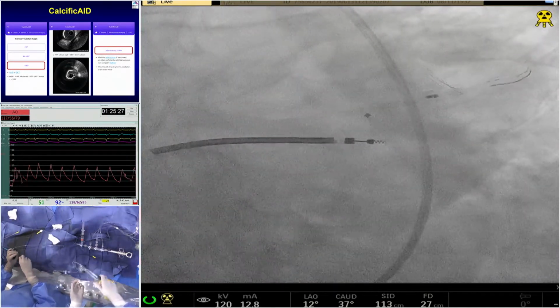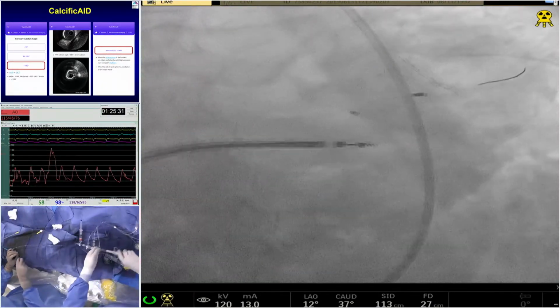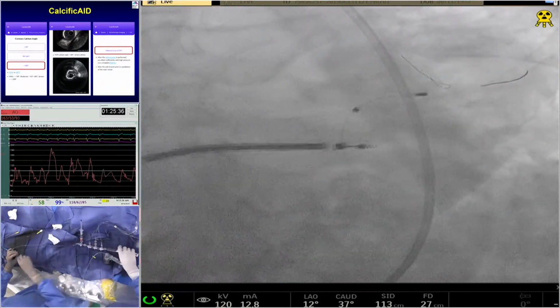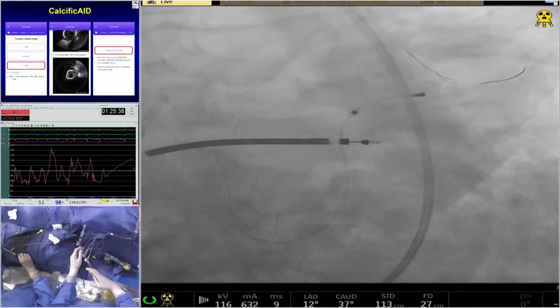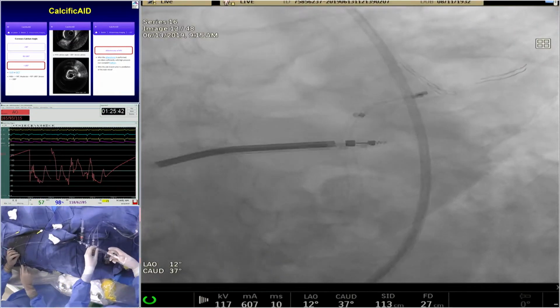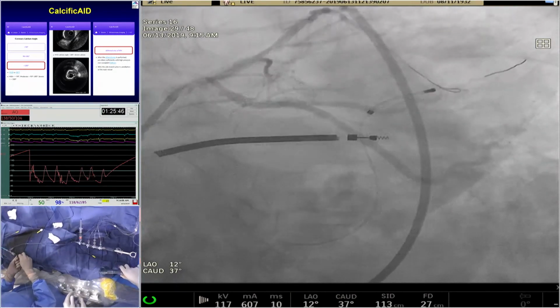I would be very, very hesitant to stent the circ ostium unless I have no choice, because we have seen time and again the highest rate of restenosis is at the osteal circ. Unless I have no choice, I wouldn't stent the circ. I will do everything to avoid that. So we are going to a 3.5 by 16 to the circ. Balloon or nothing else.